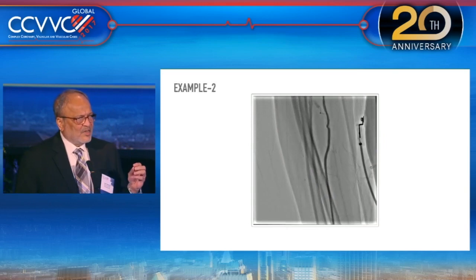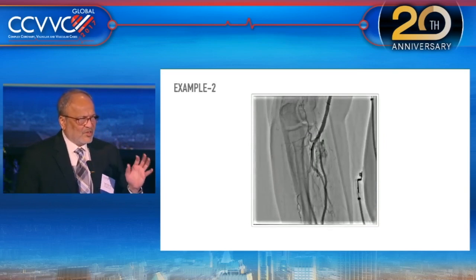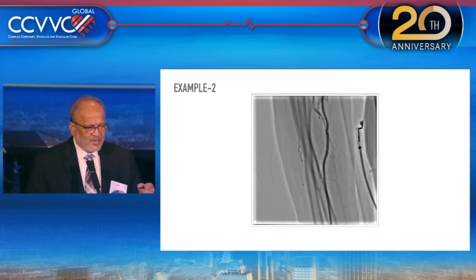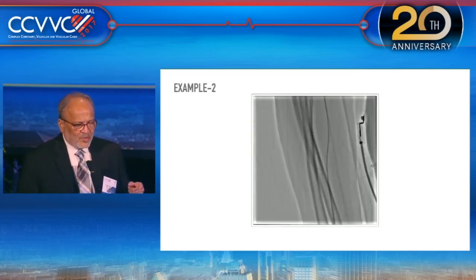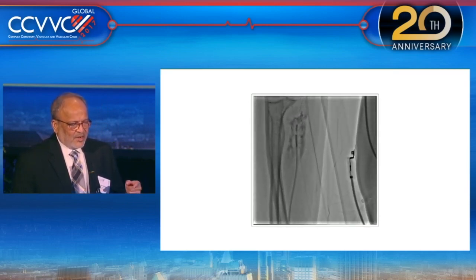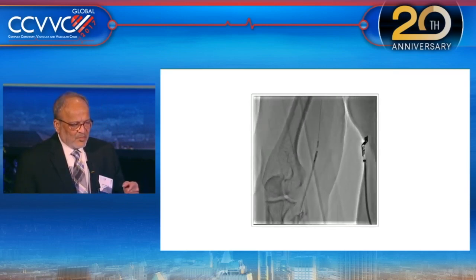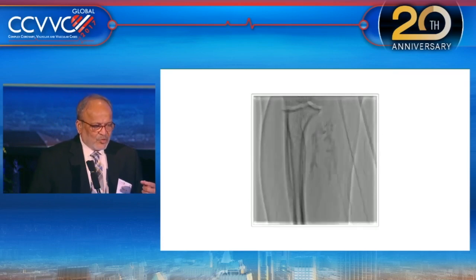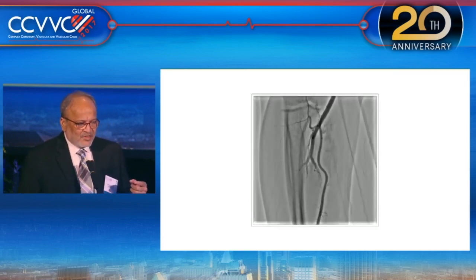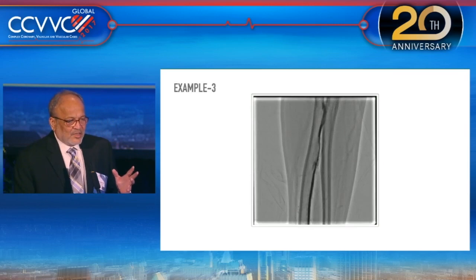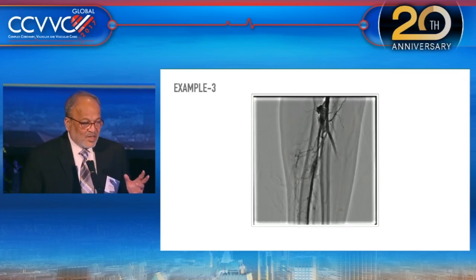Injection after the procedure can confirm that the perforation is sealed. Another example of a bad perforation going into the muscle — balloon-assisted tracking was used, and once the procedure was finished we injected and confirmed that the perforation was sealed.